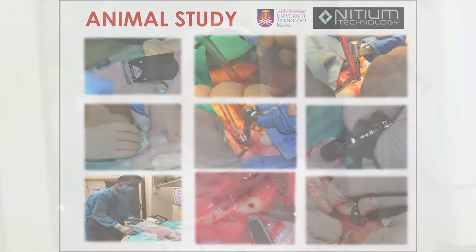For example, in the upper part of the maxilla, where the bone is very soft and there is minimal amount, we can actually make the implant shorter. With our porous implant, because bone can grow into it, we can make the implant shorter, so that will encourage bone to grow. When we can make the implant shorter, we don't need to put any bone graft. Usually with conventional implants, to make sure that the implant unites with the bone, we have to add more bone.